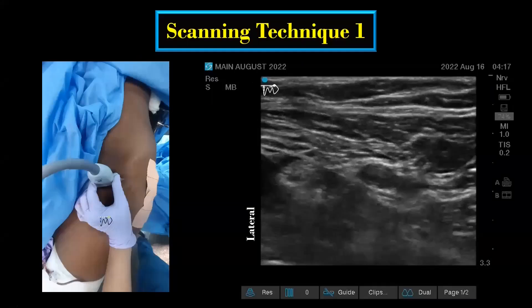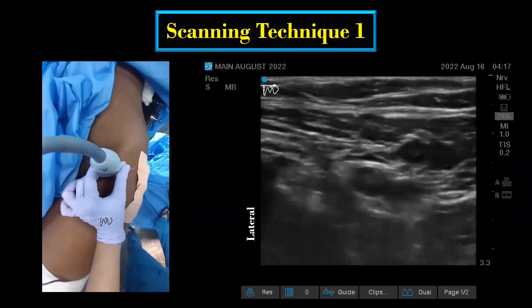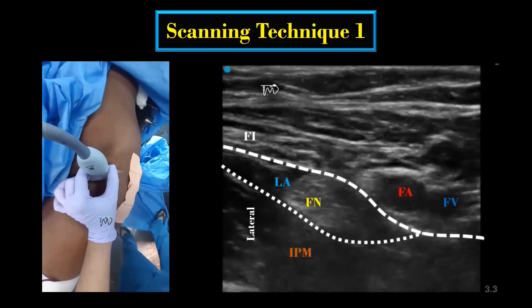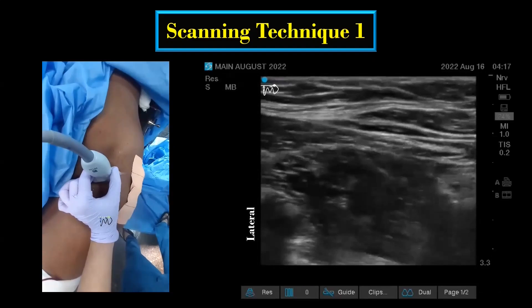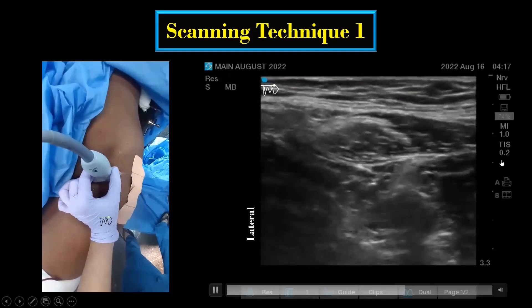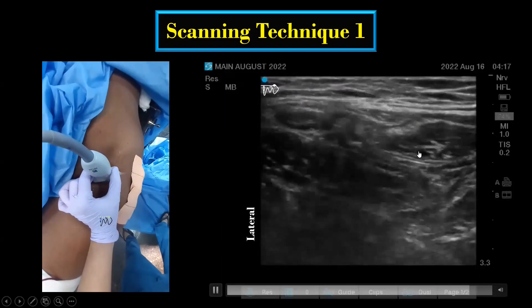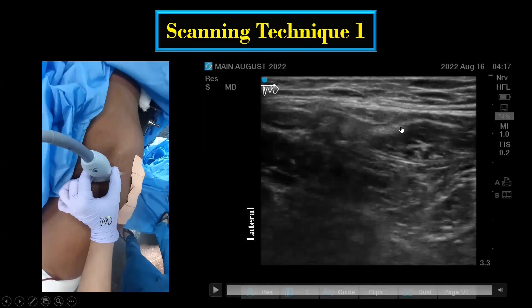The LFCN is most commonly blocked along with the femoral nerve block. In this technique, a medial to lateral scanning below the inguinal ligament is performed. After performing the femoral nerve block, the transducer is slid laterally to identify the sartorius, the tensor fasciae latae, and the rectus femoris muscles lateral to the iliacus muscle. Here, the LFCN can be visualized in a fat-filled space between the tensor fasciae latae muscle and the sartorius muscle. A small pulsatile superficial branch of the lateral circumflex femoral artery is almost always associated with the LFCN at this level, which can act as a surrogate marker for its identification.